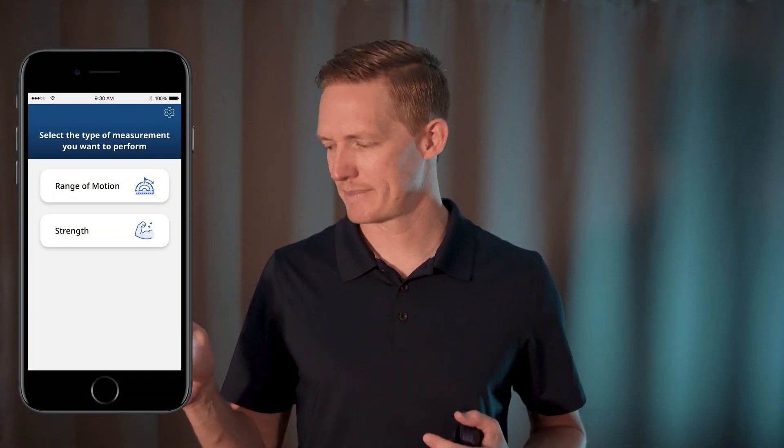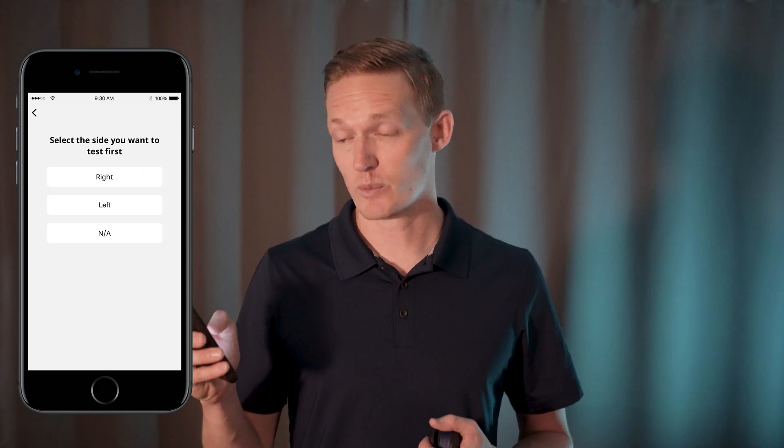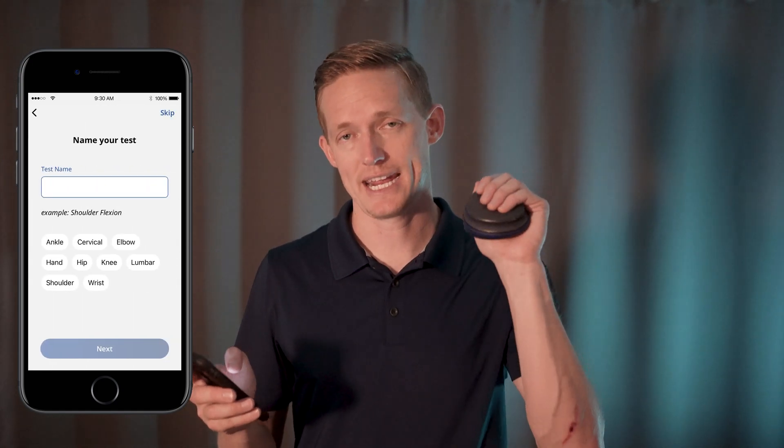You'll also need to download the ActiveForce 2 app on your mobile device. To perform a strength test, we'll go ahead and tap that strength button, select the side we wish to test, and in my case I'm going to do a hand and grip strength.